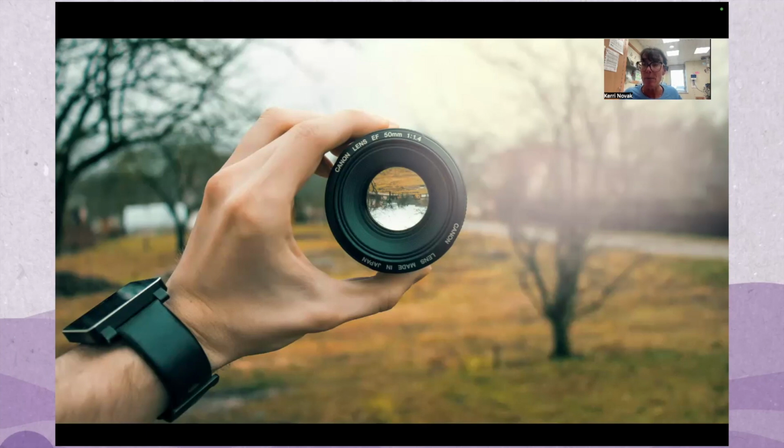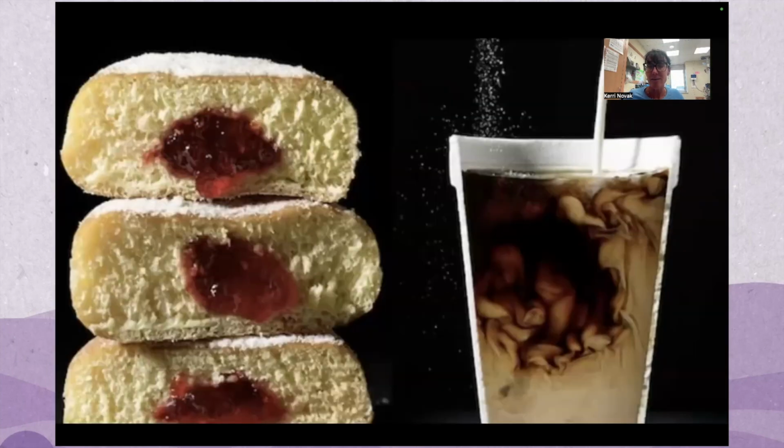Crohn's disease, for example, affects all layers and can even result in penetrating complications outside of the wall of the bowel. So this image really depicts how we see things and the limited advantage that we might have if we only use one test, and the importance of combining tests in addition to how you feel in order to understand your disease.